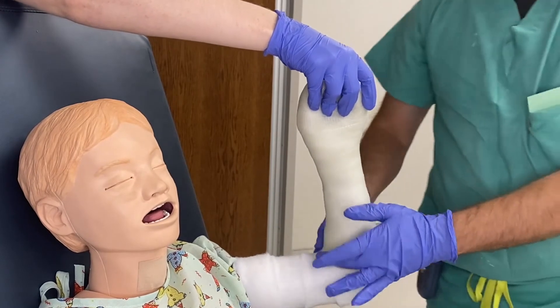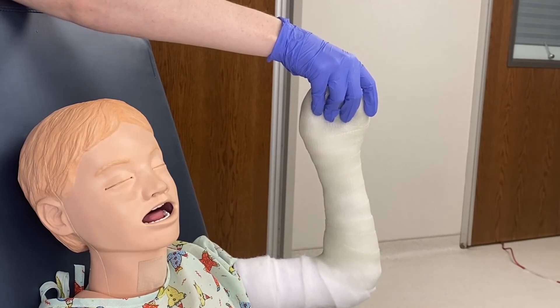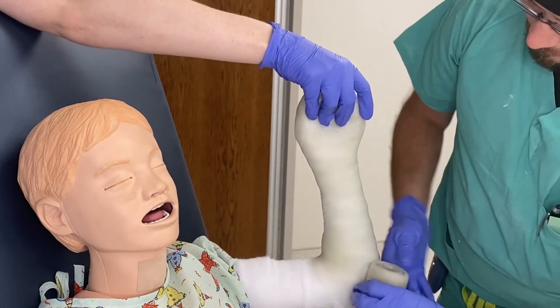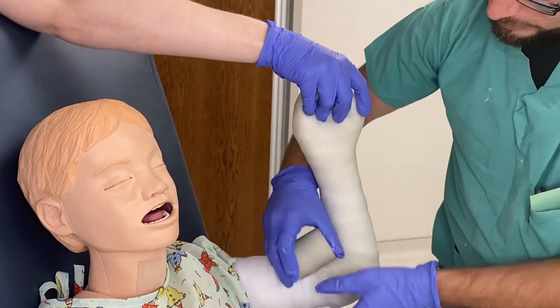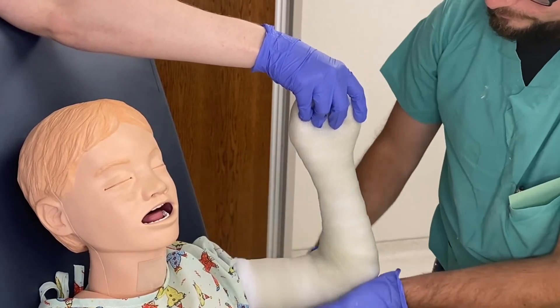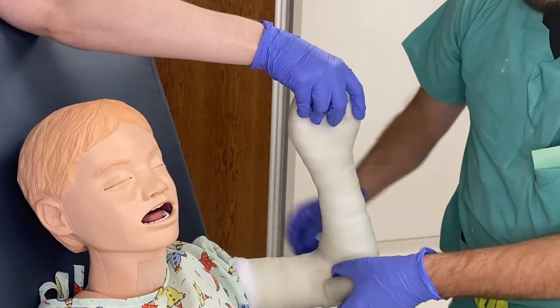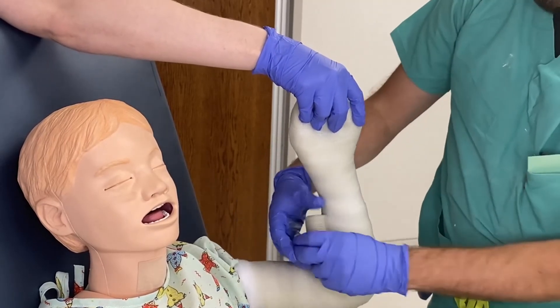Around the elbow we have the ballerina spot, and we're going to tilt — or pivot — at that point. Ballerina spot 50-50, ballerina spot 50-50, and then even up and continue the rest of the cast. For this one I'm just going to do five layers — you need five or six layers. I'm coming back not doing 50-50 but doing a single layer.